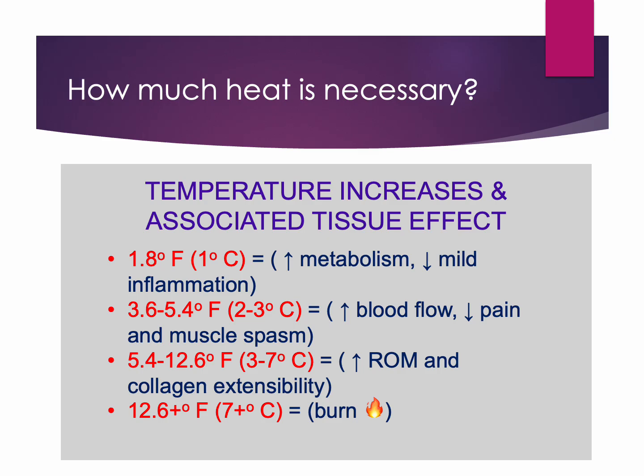This slide shows the minimum amount of heat required to treat based on your treatment intent. This becomes part of your clinical reasoning for your thermal ultrasound settings. For example, if you are heating prior to stretching, you need to increase the temperature of the collagen tissue by at least 3 degrees Celsius.